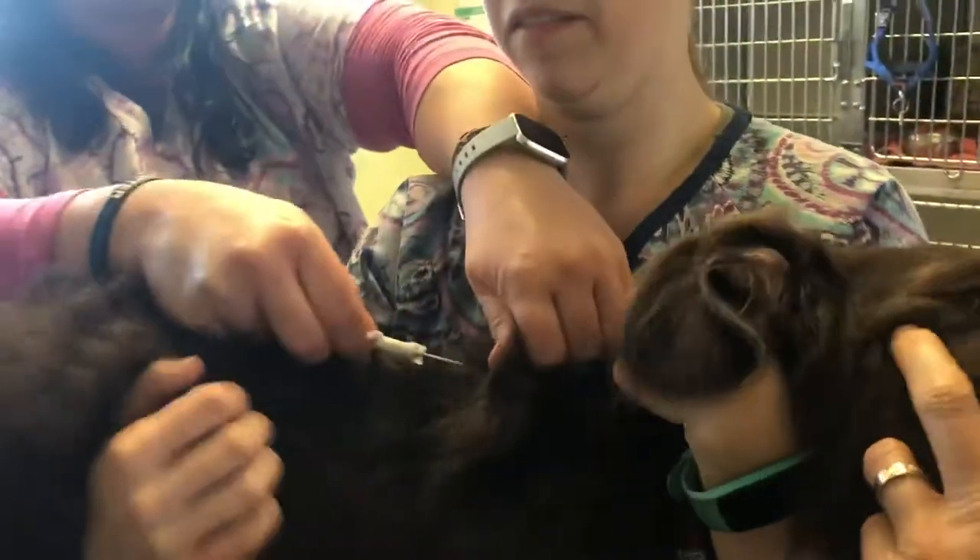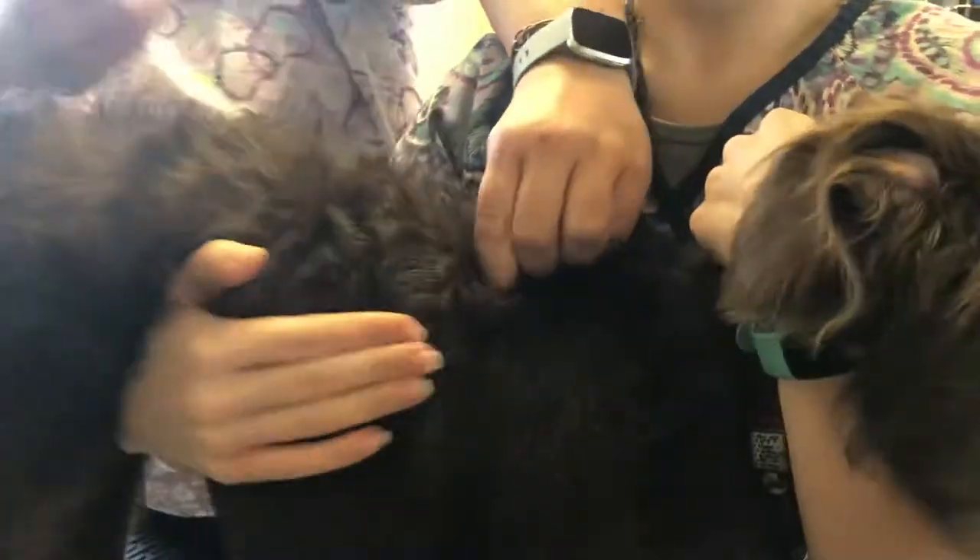There is the microchip right there in that needle. I tell people it's just like giving a vaccine — it goes underneath the skin in the area of the shoulder blades. We're gonna try to keep her busy by playing and do the demo. Inject, push the plunger, and there you go. There's the microchip.